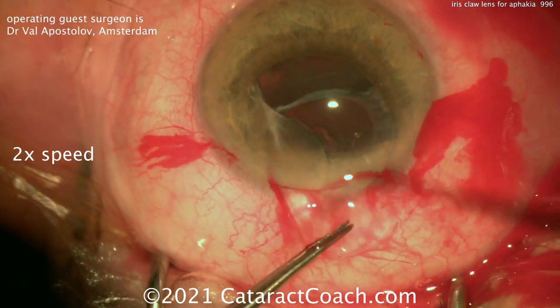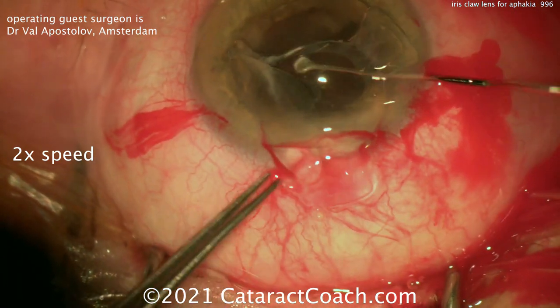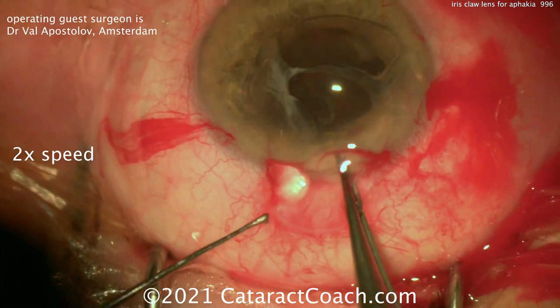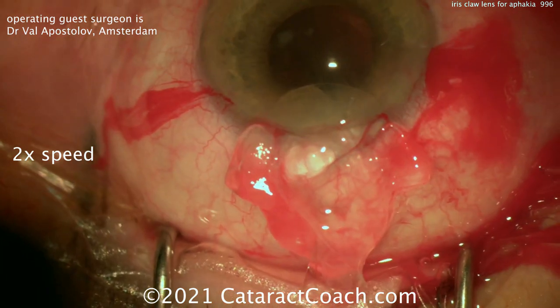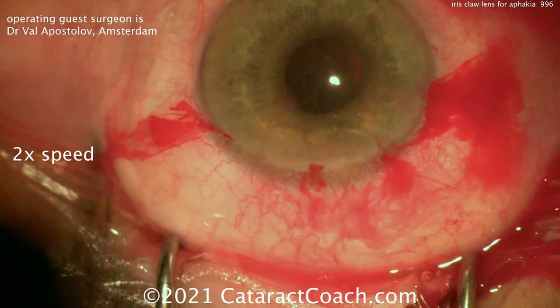As you bring the lens up, it will automatically be broken. There's the lens that can be brought out through the incision, using a second instrument to help. We've sped up the video at two times normal speed just so we can show you the whole case. You want to make sure those zonular attachments are broken and this lens can just be pulled out of the eye along with the capsular bag — there it is, brought outside the eye. Depending on the lens, you can have a reasonably small incision size.